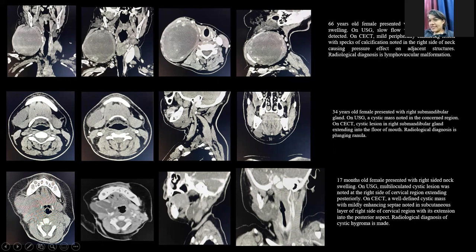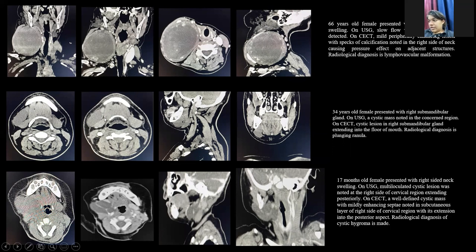A 34-year-old female presented with right-sided submandibular gland swelling. On ultrasound, a cystic mass was noted in the concerned area. On CECT, a cystic lesion in the right submandibular gland extending to the floor of mouth was seen. The radiological diagnosis of plunging ranula was made.